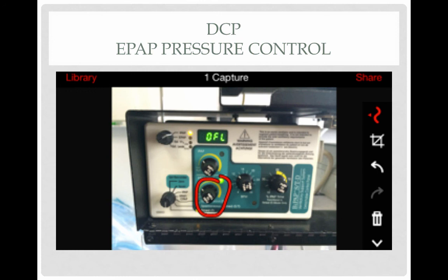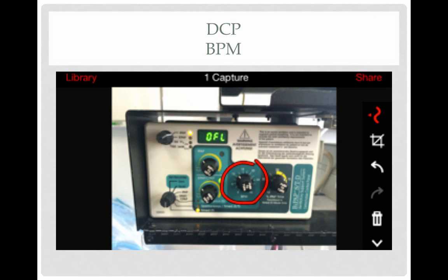This one is the breaths per minute control. We generally are going to set that 2 or so or more units below their actual respiratory rate. We never want to set this more than their respiratory rate. If they have such a low respiratory rate starting off, something below 8 probably, we would not want to use non-invasive ventilation. We need a spontaneously breathing patient, so this is really just a backup rate in that circumstance where their respiratory rate may fall a little bit low.